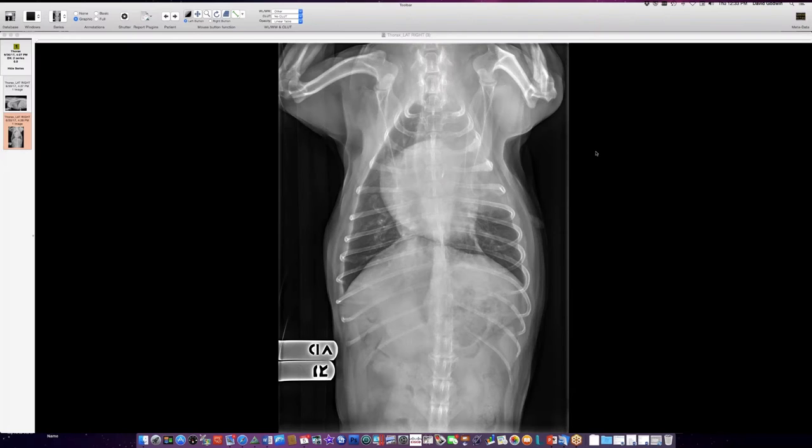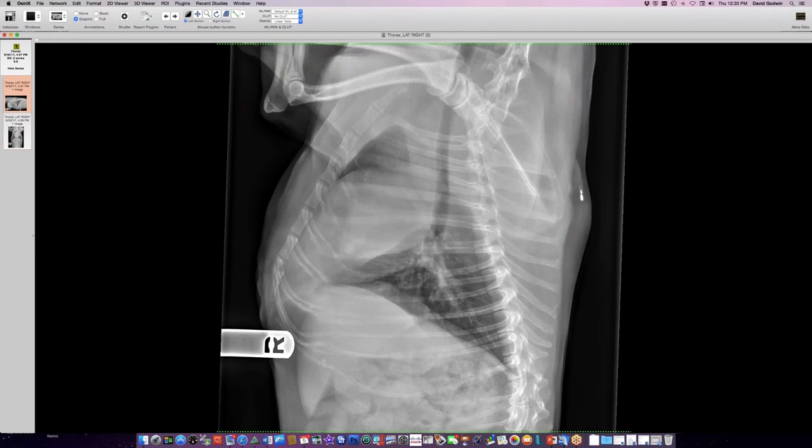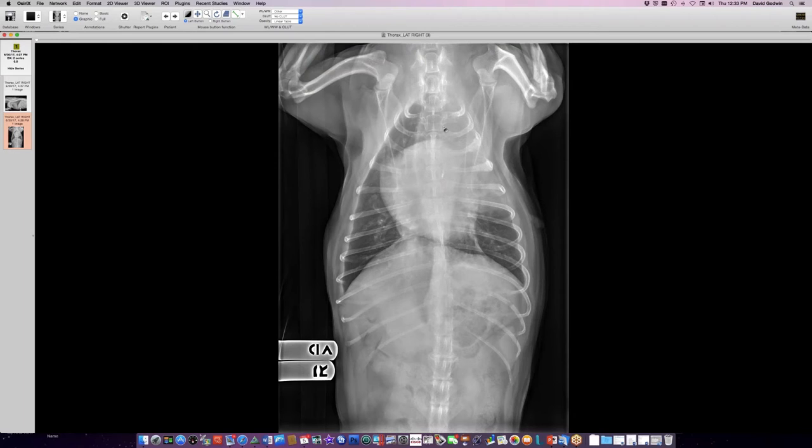Okay, so this is a fairly young individual, I think 14 years old, with intractable cough, who is not eating very well and is losing weight. So we have this radiograph here. I'll show you a lateral. Here's the lateral view, and there's a sharp lower margin to this opacity that occupies the left upper chest. This individual went on and died, and with the weight loss and all, this was determined to be a lung cancer, but there was no autopsy on this young person, only 14. Of the canine persuasion, in case you haven't tumbled to that. So this was a presumed lung cancer in a dog.